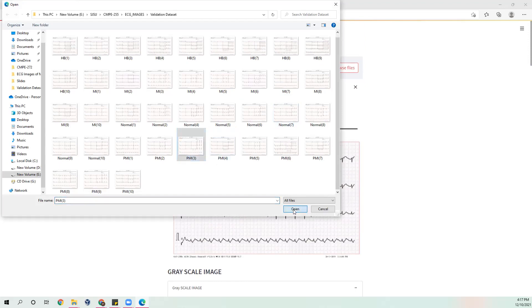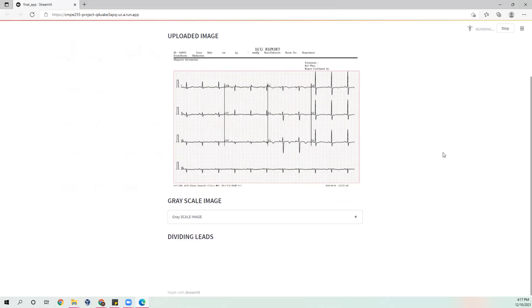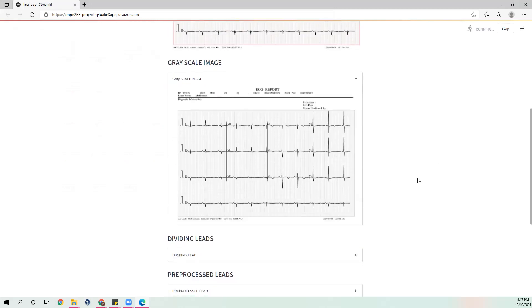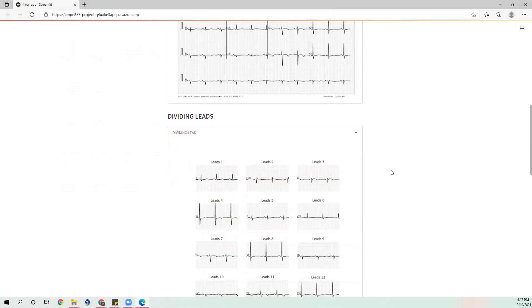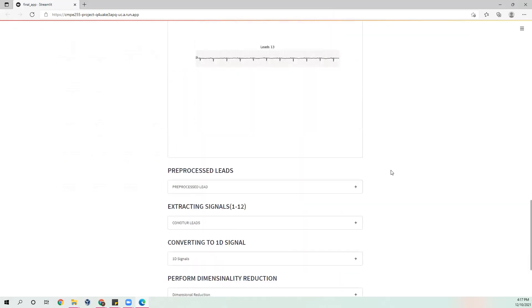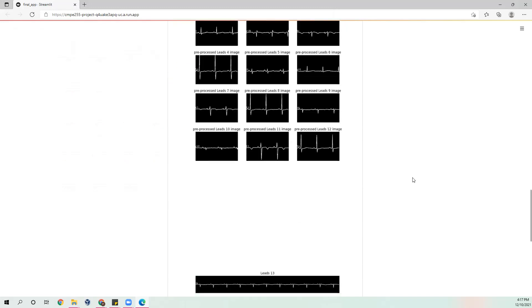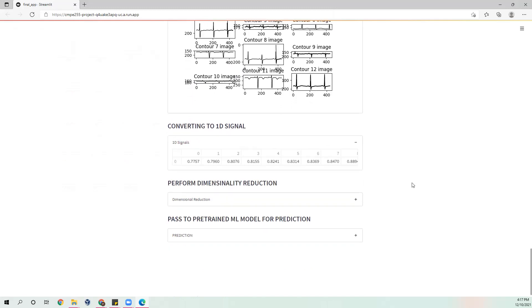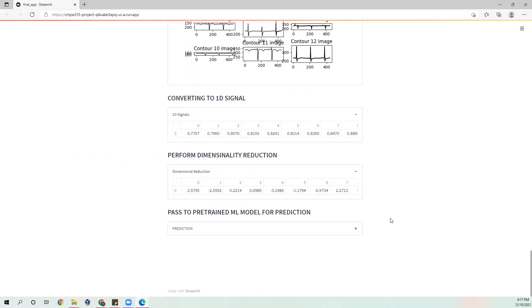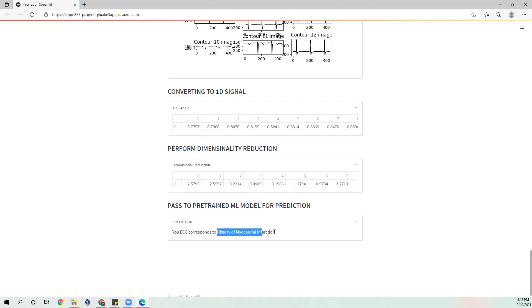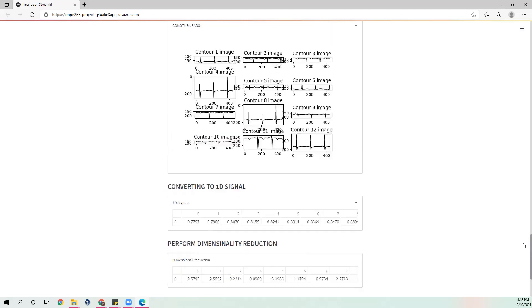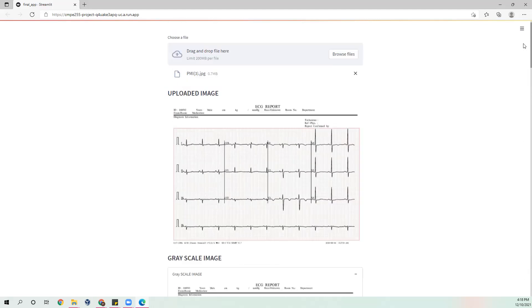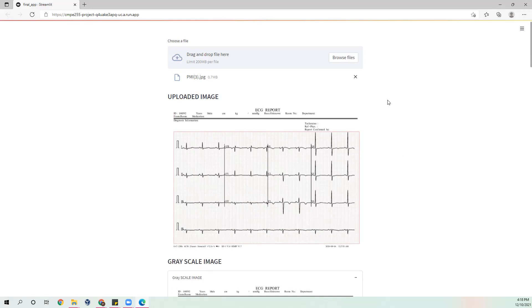Going on to the last category: the prediction is history of myocardial infarction. This is how the prediction works across all categories.